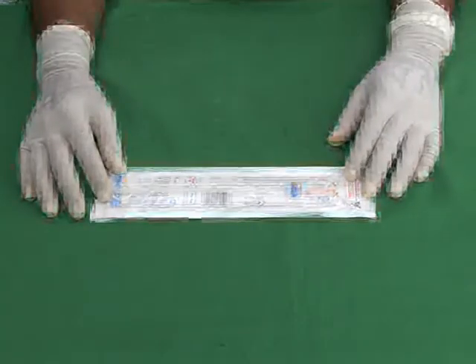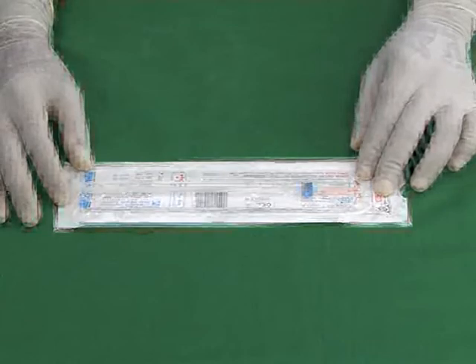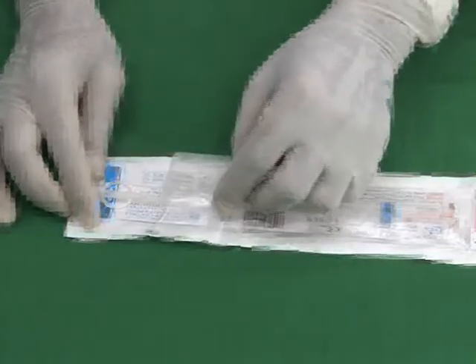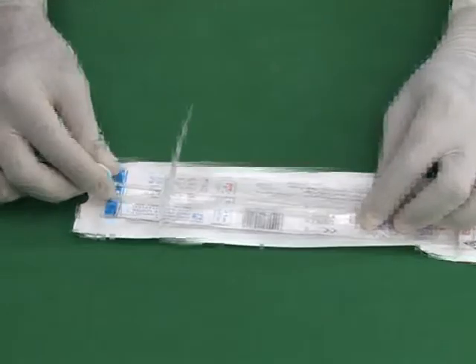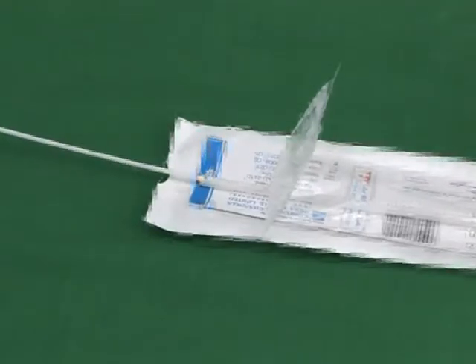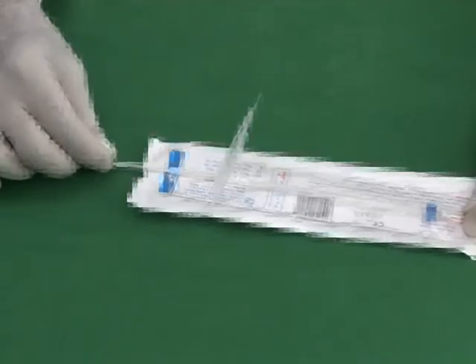Now let me demonstrate how to load the intrauterine contraceptive device. First, you open the pack on the opposite side of the intrauterine device. Do not open it completely but partially. Then you take the inner white rod and insert it into the clear outer tube and push the inner rod up to the bottom of the intrauterine device.